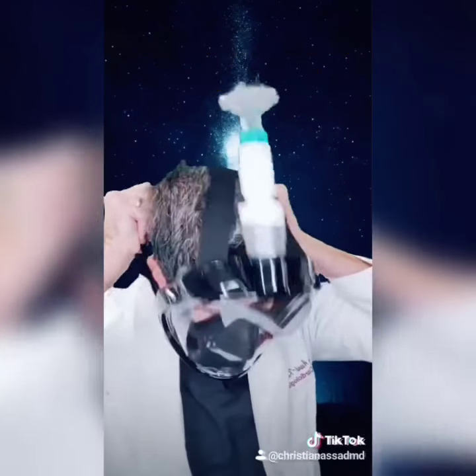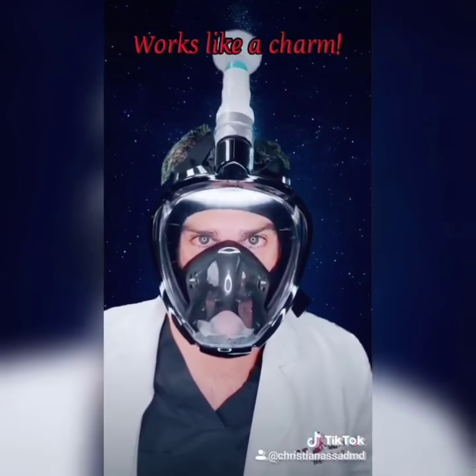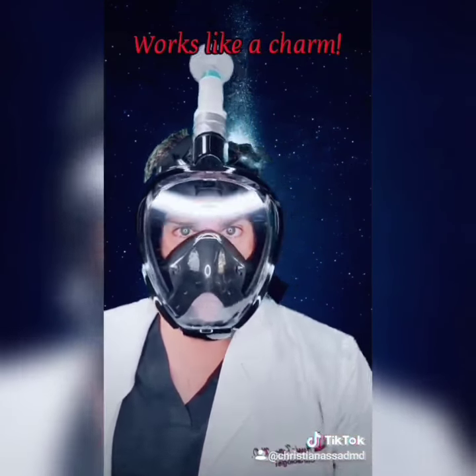You've got your filter, and now you've got a respirator that functions perfectly well. Awesome.